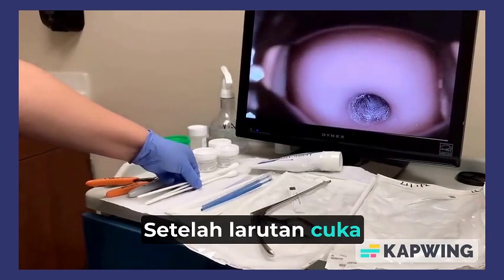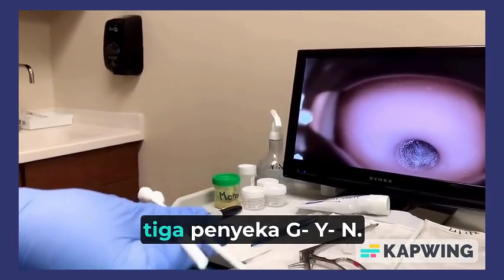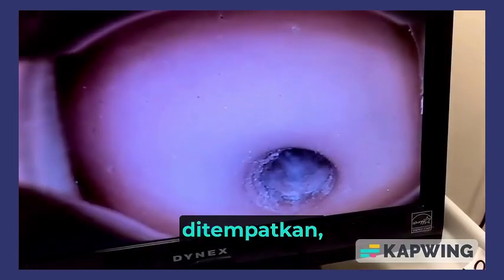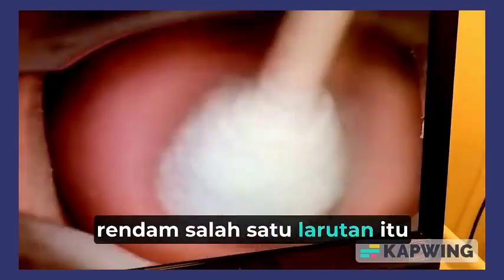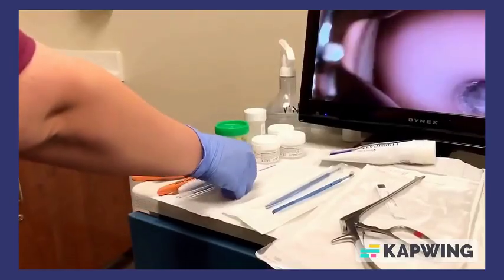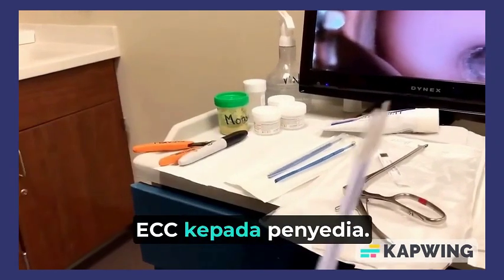After the vinegar solution has been sprayed onto the cervix, the MA will give the provider 3 GYN swabs. After the vinegar solution has been placed, the provider will grab the swabs, soak up any of that solution, and disperse it onto the cervix. After that is done, the MA will give the provider the ECC swabs.